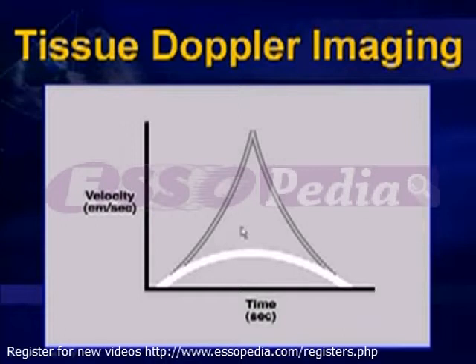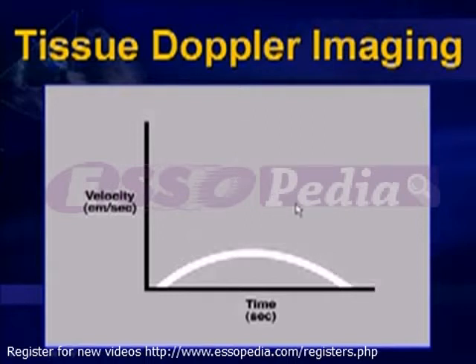In spectral blood pool Doppler, this is considered noise in the signal, so we just simply turn wall filters on. In Doppler tissue imaging, that is in fact the signal that we are interested in. So to obtain this, we must simply turn the wall filters off, and now to get rid of what would be considered noise in the signal coming from the blood pool, we just simply turn down the gains, because the blood pool spectral Doppler is of much lower intensity.